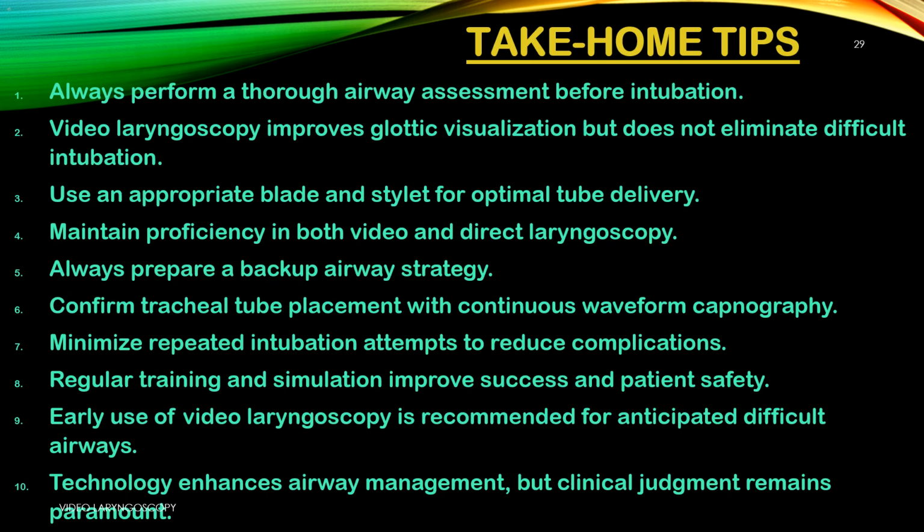7. Minimize repeated intubation attempts to reduce complications. Too many tries cause trauma and low oxygen. Stop, oxygenate, and change strategy if needed. 8. Regular training and simulation improve success and patient safety. Practice on mannequins keeps skills sharp for real emergencies.